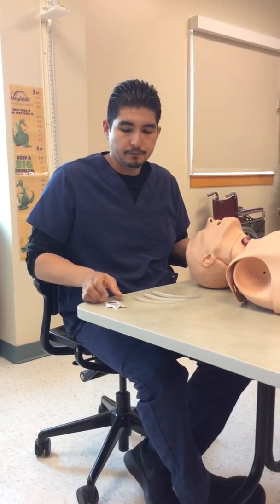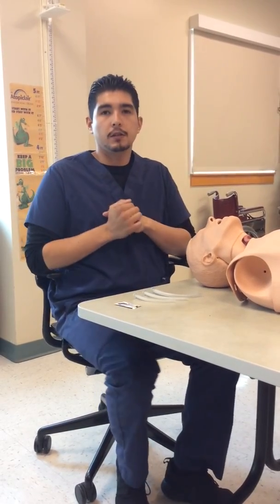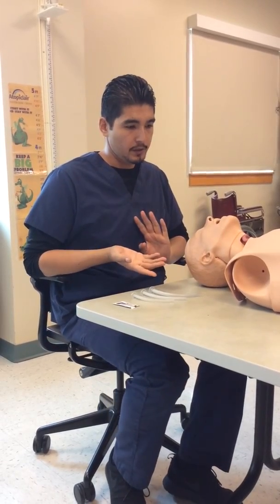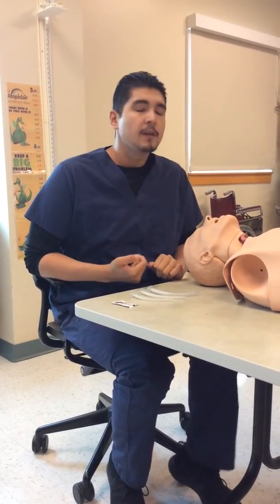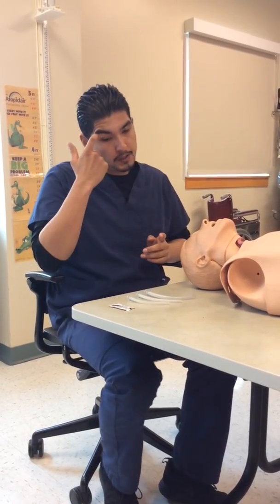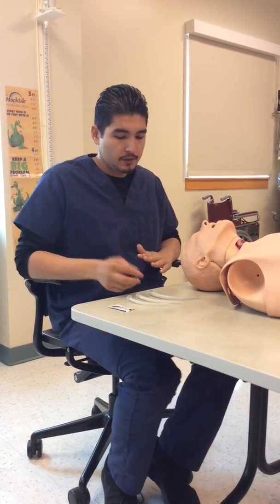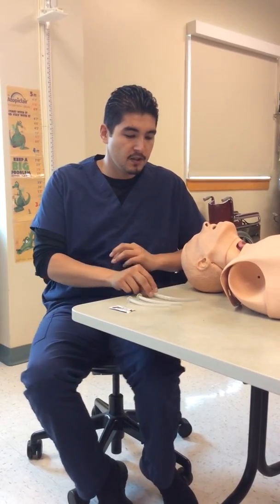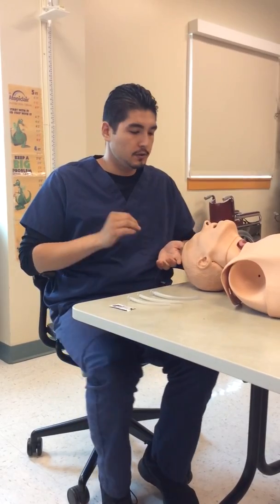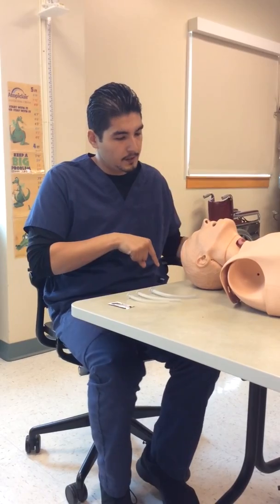Once you gather your equipment, then you can walk in the patient's room, wash your hands, introduce yourself, get their first and last name, date of birth, check their medical record number, and explain the procedure. So you're going to want to state to your patient what you're going to be doing. So you say, "Sir, I'm going to be inserting a nasopharyngeal airway. I see you have a lot of mucus accumulated, and we're going to need to suction you often. So we're going to go ahead and just put in an NPA."